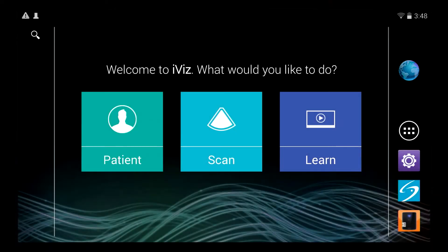There are three ways to start a new patient study. You can select a patient from the scheduled list, or enter a new study from the search menu. You can also start a new patient study after completing a scan.